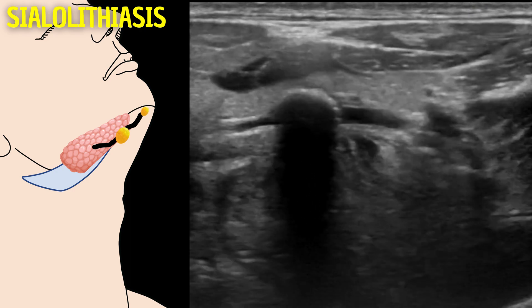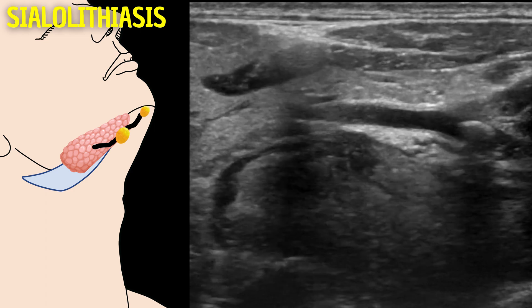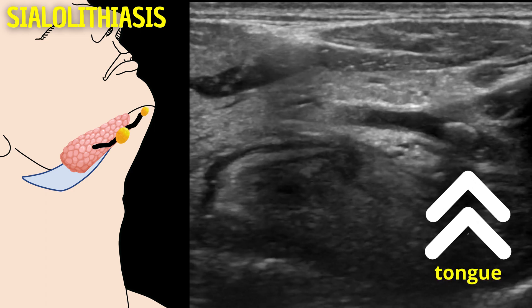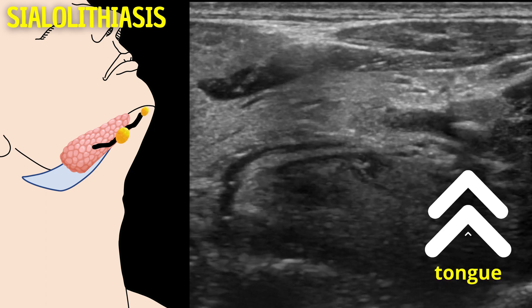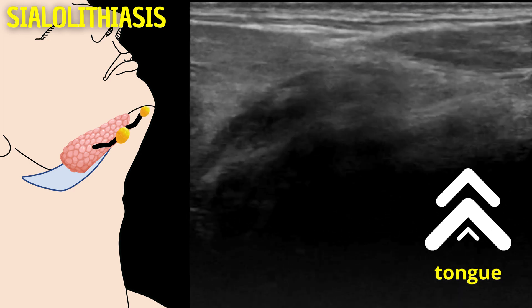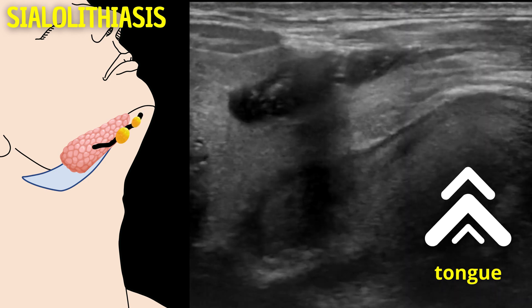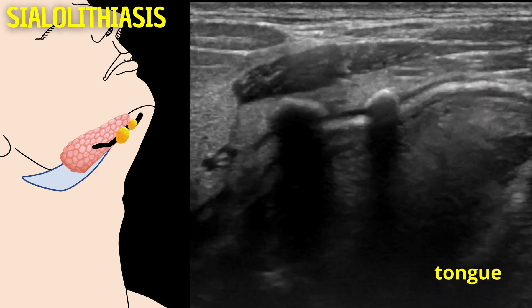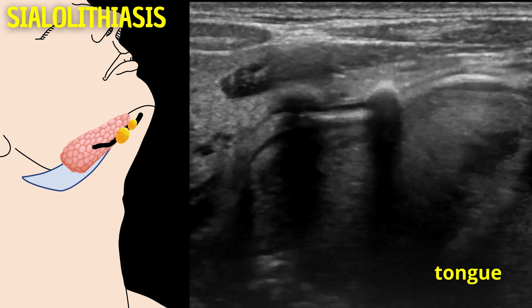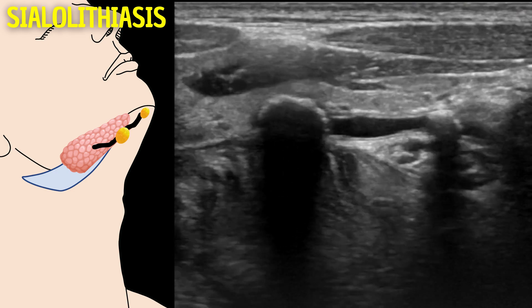An innovative maneuver was employed where the patient was instructed to press the floor of the mouth downward with the tongue. This led to a captivating moment captured on ultrasound: the distally located calculus was observed to migrate towards the mid-portion of the duct, nearing the first detected calculus. This dynamic movement illustrates the mobility of the calculi within the duct and highlights the potential for patient-induced maneuvers to aid in the diagnostic process.